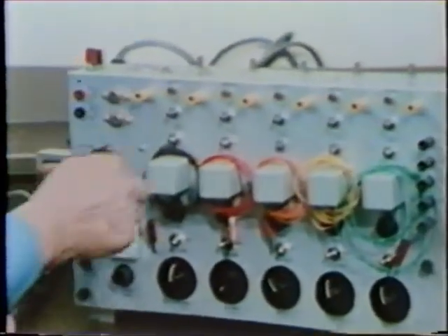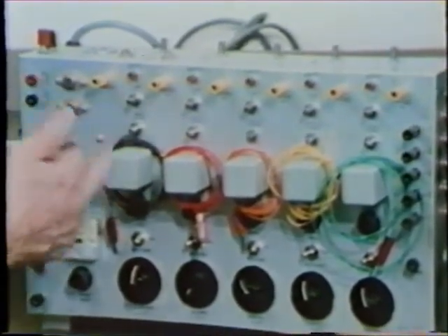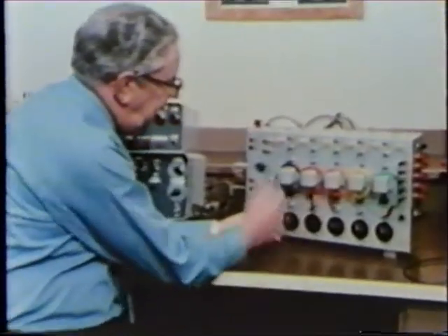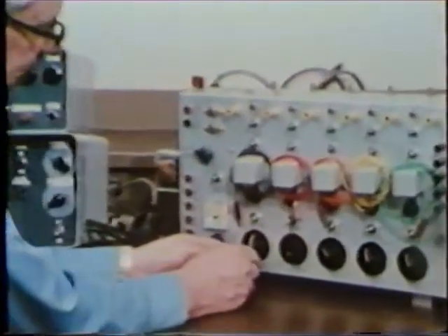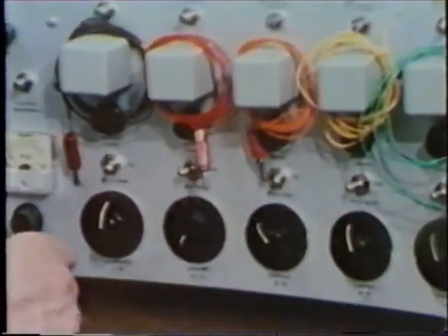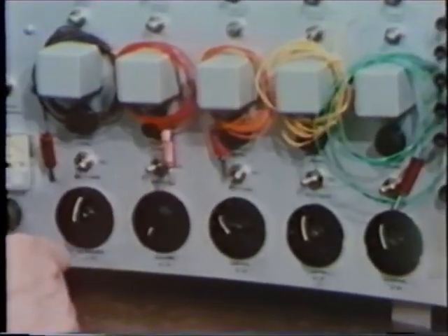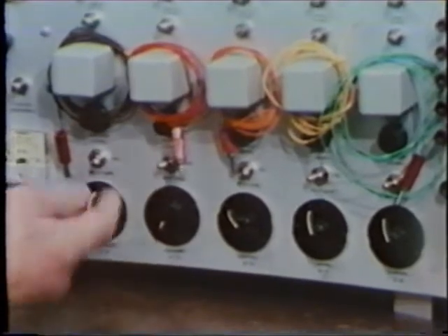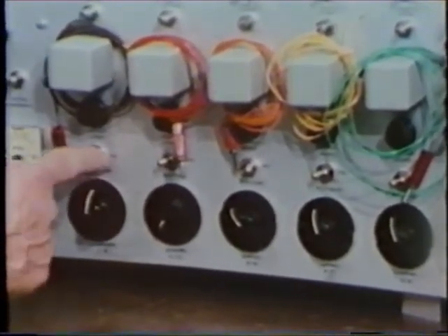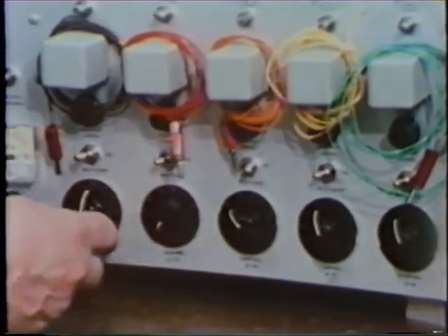This piece of Jack Urban's electronic wizardry makes it possible to put various bands of the speech frequencies into separate electrodes, either with or without a carrier wave, and also to count down these frequencies at the same time. Same could be done with all of the various bandpass filters. We also had the ability to divide this entire ratio down by a factor of 2 again, making it possible to divide the signal down from 1 to 22.